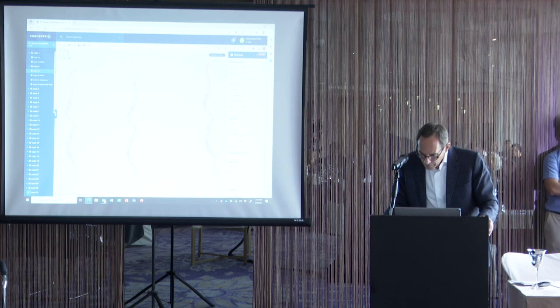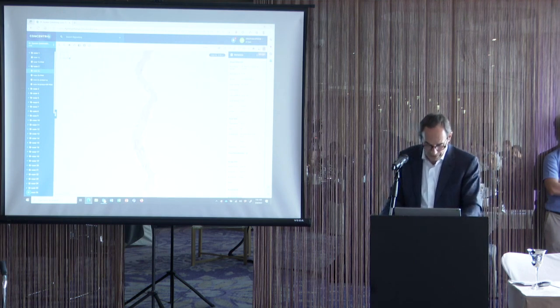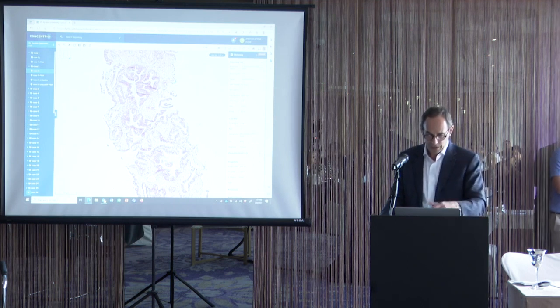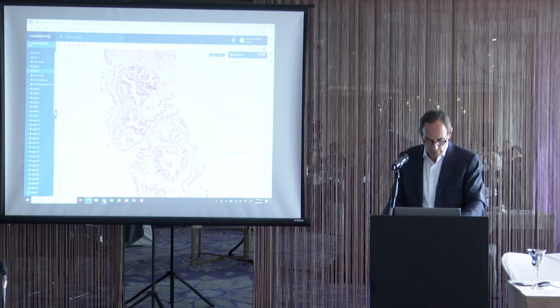Okay, this is a patient with elevated serum PSA level. Again, nothing that's specific. And this is one of the things that I talked about earlier, so we'll go over it again on a case so we can move the slide around a little bit. So what I see here at low power is some of these glands that look more benign architecturally. They're larger glands, some infolding, but they look darker. So when I see that, I think of PIN. So I think, okay, it could be PIN.